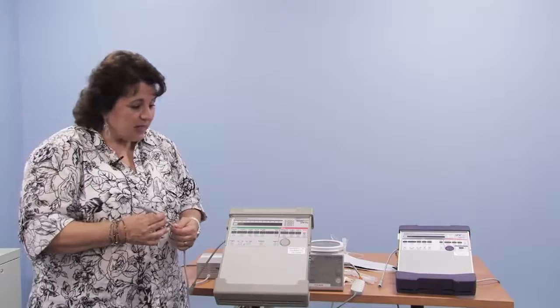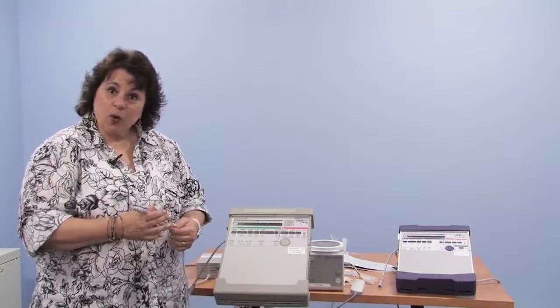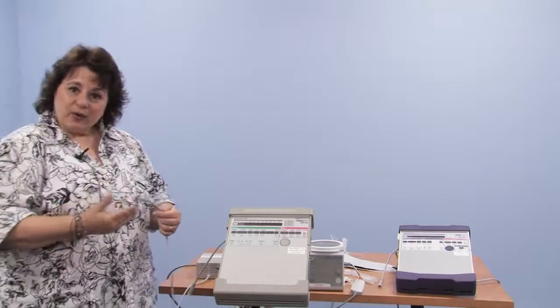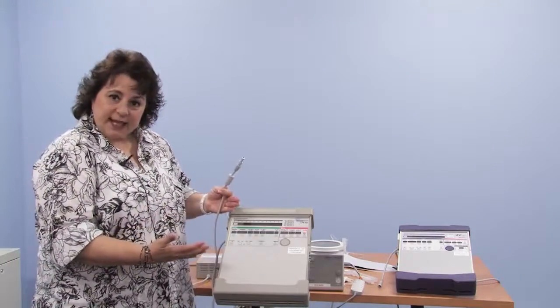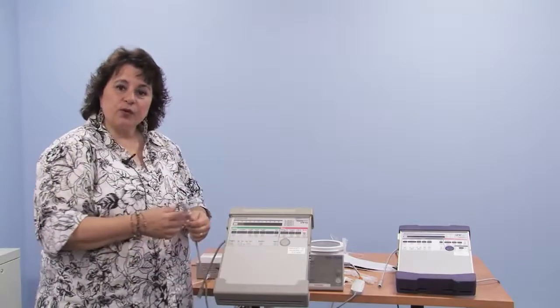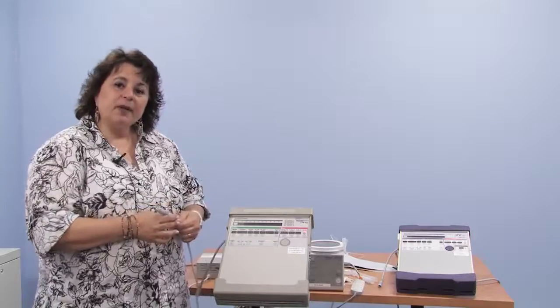In addition to that battery, there are portable batteries, which I'll show you in a little while, for when you take your child out of the home on a ventilator. There is a lithium-ion battery that fits in a case very nicely in front of the ventilator that runs about 6 hours. So we will show you that setup later.